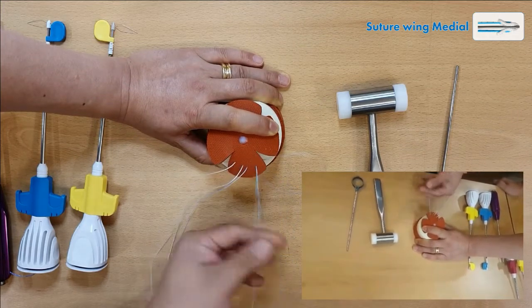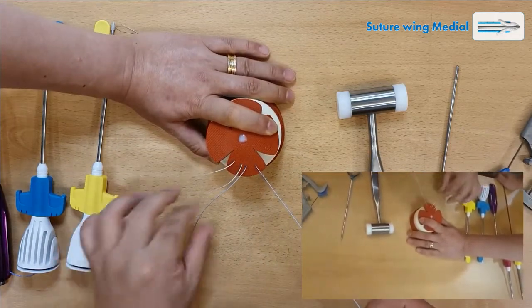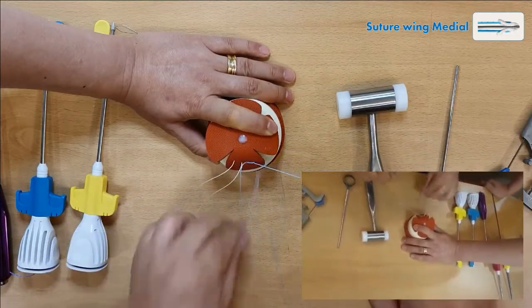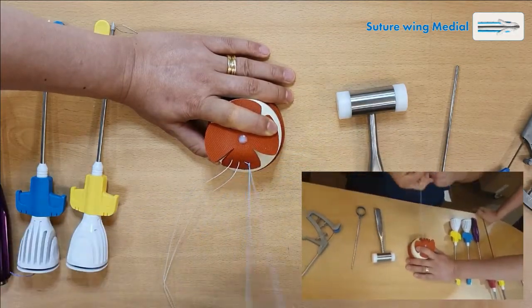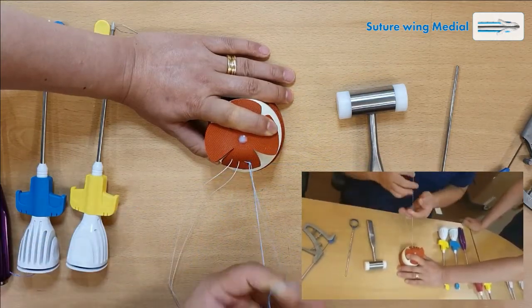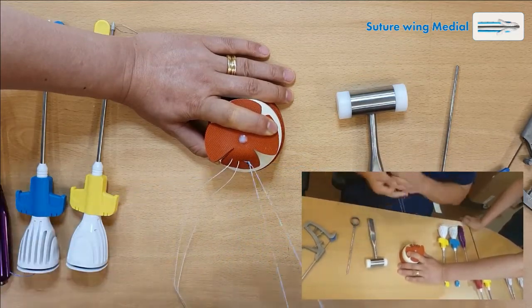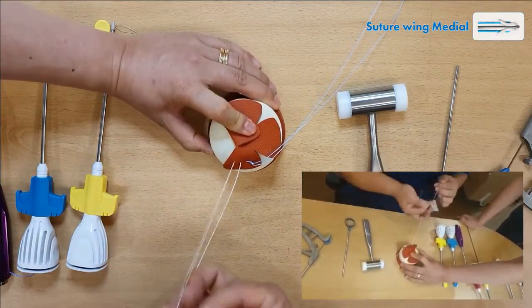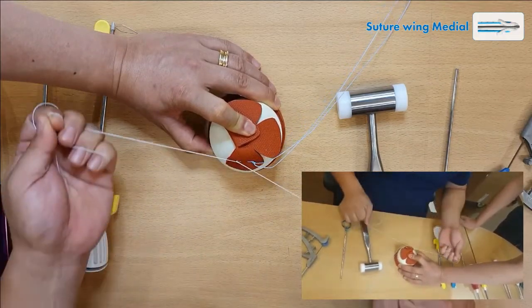Now I have passed all the fiber wires. I'm just going to tie it. Since we are using this little model, I'm just going to tie it with the hand.